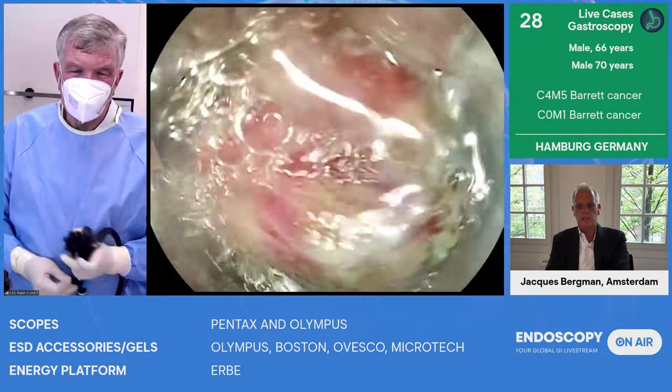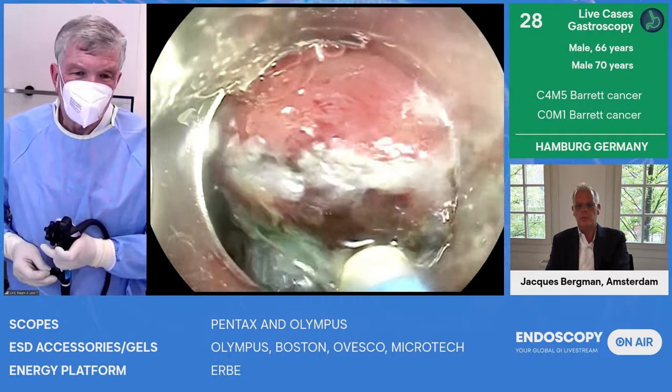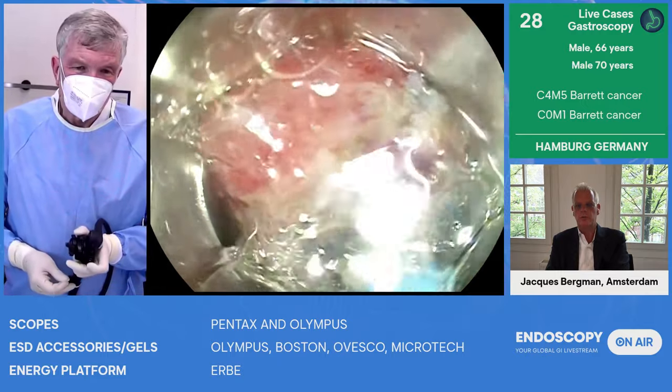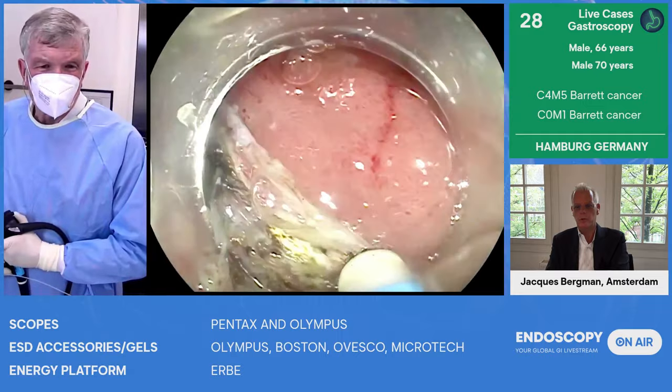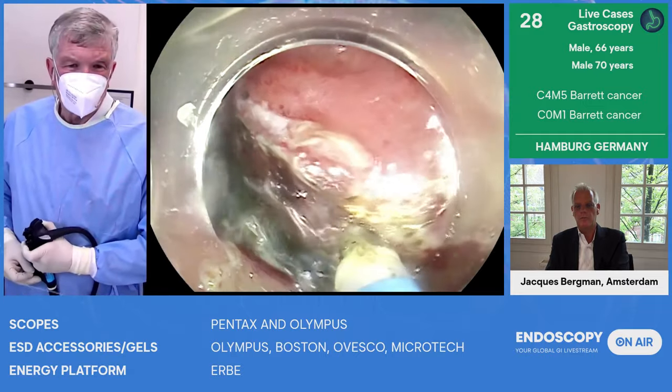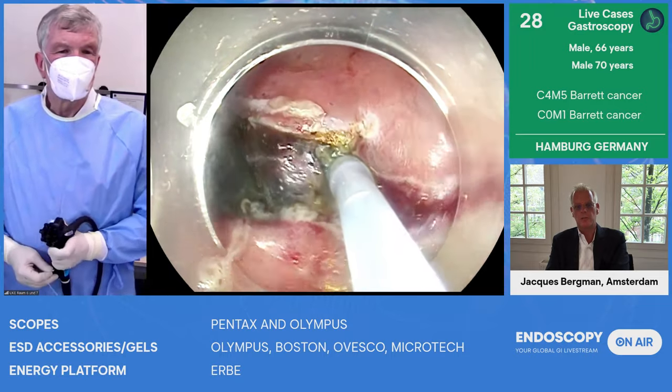So now you can see that, since you're wedged with your cap, this is a very stable position. The lesion is at 12 and your cap is stabilizing the position. So that's a beautiful, very elegant way of cutting in the same plane.